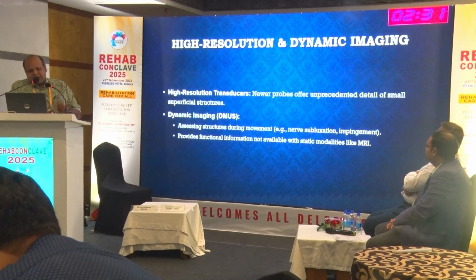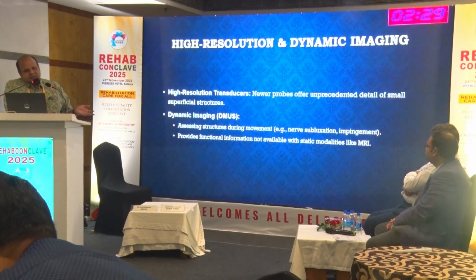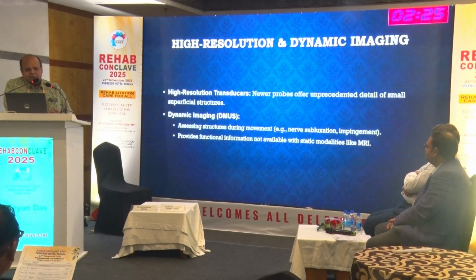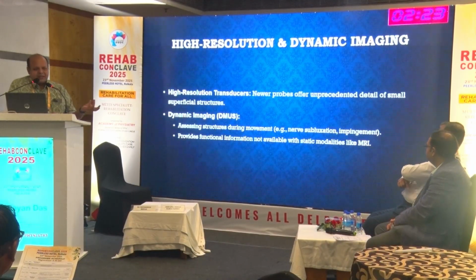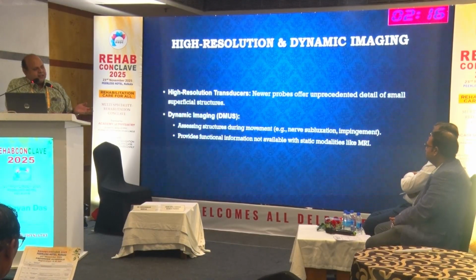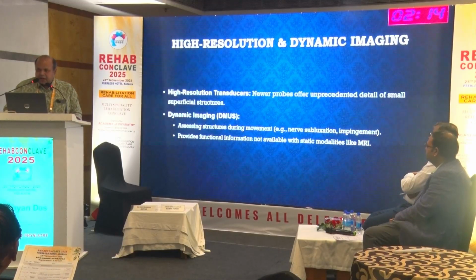The high resolution and dynamic images, again, I have already shown the high resolution probe. It's just the crystals are different and the filters are different. The probes are a bit costly, but that gives you good images.